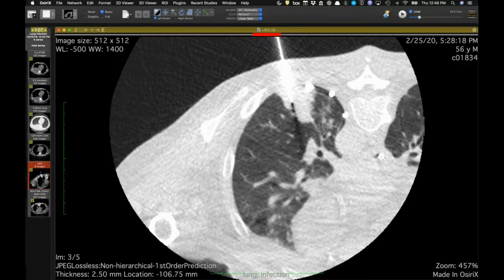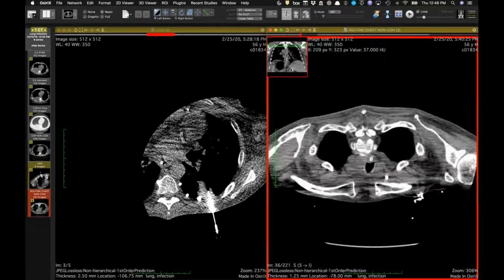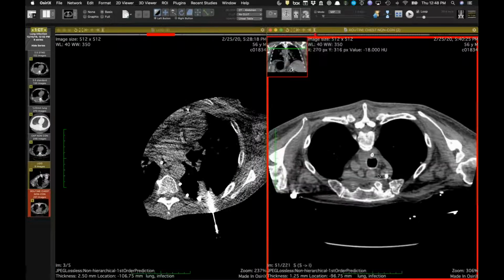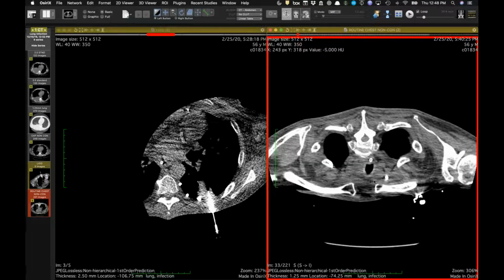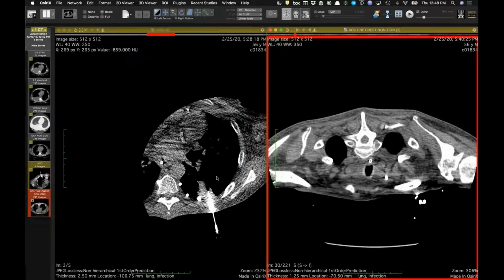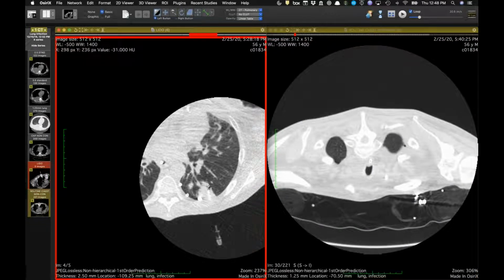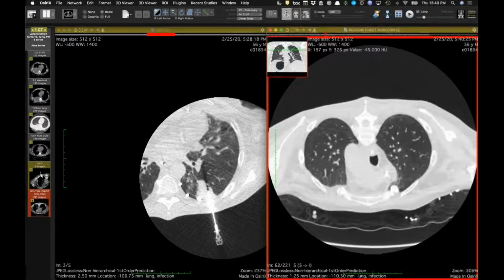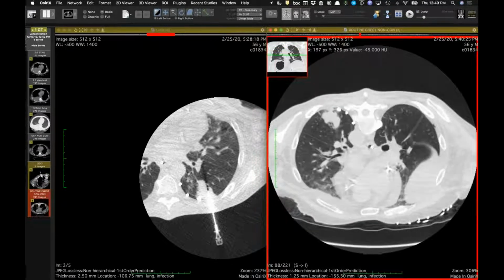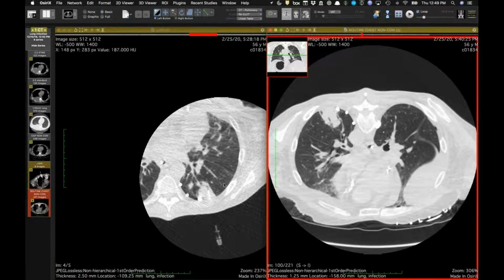And I will show you, we also did a simultaneous acquisition just of a conventional CT. And you can see that the airway is still thick a little bit here. And that was actually edematous and inflamed when they did a bronch. And any guess as to what the bug is? Cryptococcus. What's that? Cryptococcus. Not Cryptococcus. This is Nocardia. This is another one that I hear you speak of in immunocompromised patients on occasion.